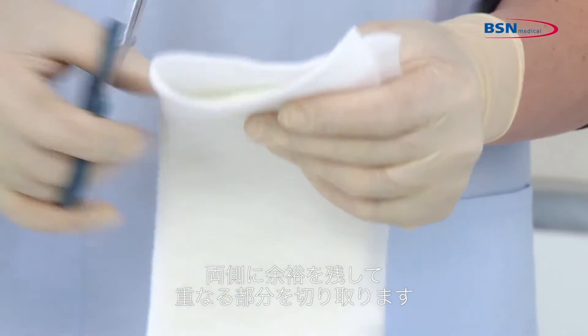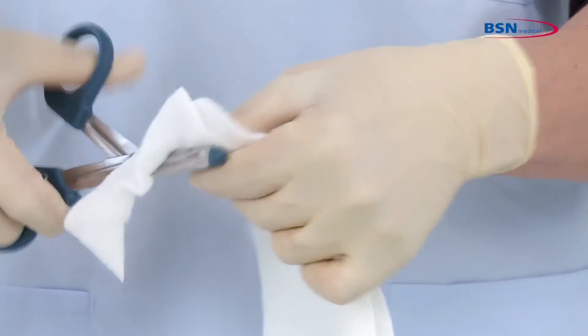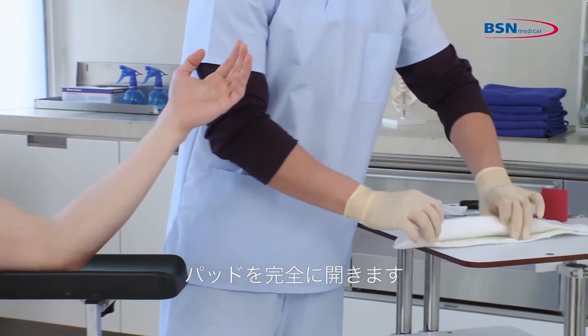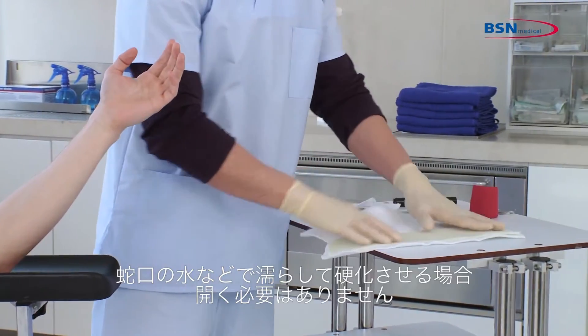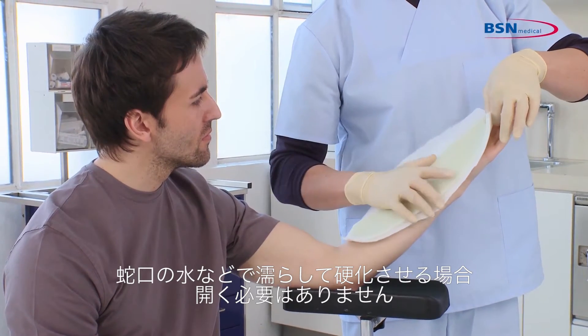Trim the overlapping padding, leaving a margin of padding on either side. You can open the padding completely. If you use a bucket of water or faucet for water activation, you do not need to open it.